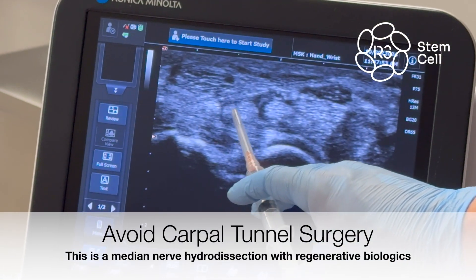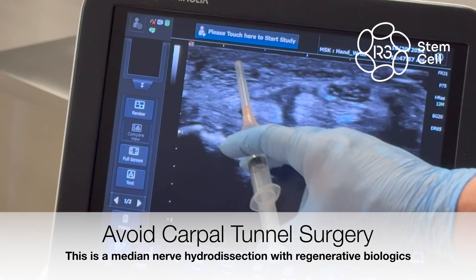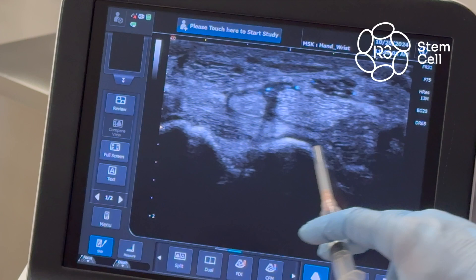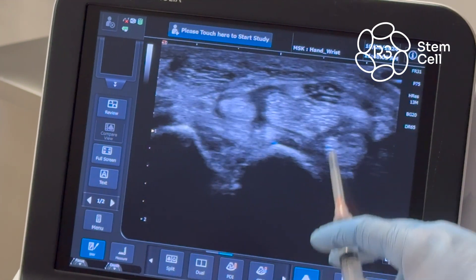Flexor digitorum superficialis, flexor pollicis longus, flexor carpi radialis, flexor digitorum superficialis, flexor digitorum profundus. The lunate bone is your bony surface down here.